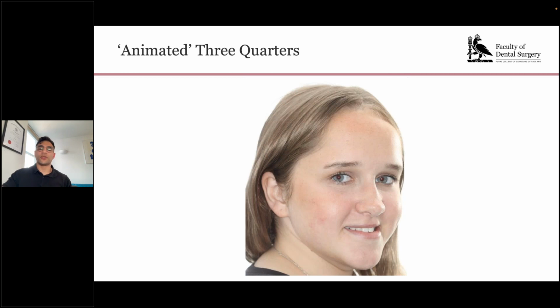And some individuals like to take what's called an animated three-quarters photograph. And that's essentially a three-quarters photograph where you get the patient to turn only their eyes to the camera. And it gives a more, I guess the word animated is probably the best way to describe it.